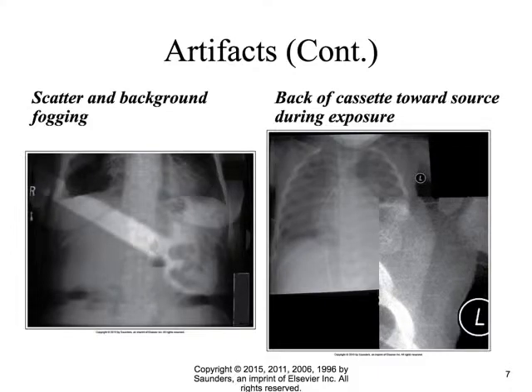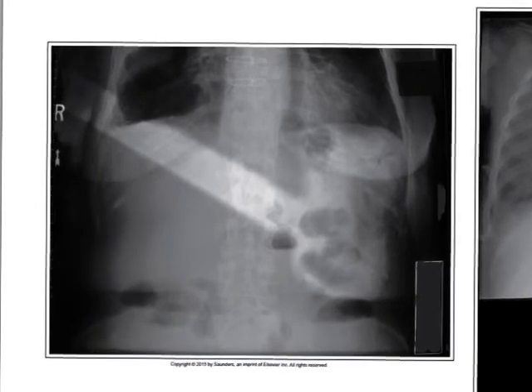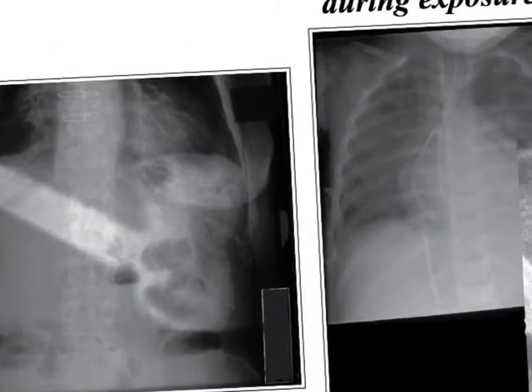This goes back to the large gentleman I was doing the chest x-ray on, right? I got some scatter radiation on my image. It wound up looking like this person's playing an air guitar, right? I have this weird pattern here of exposure.